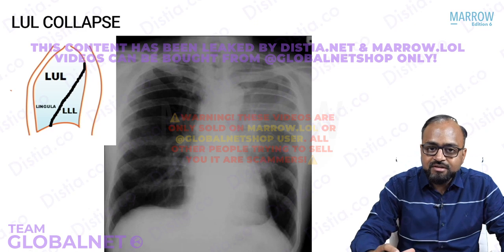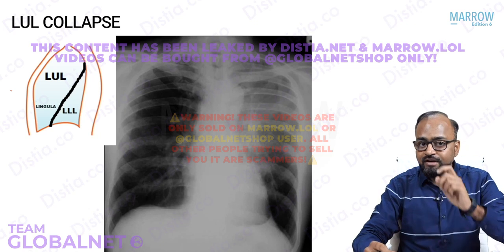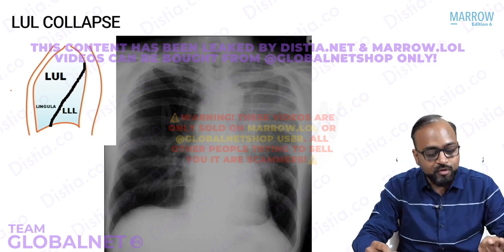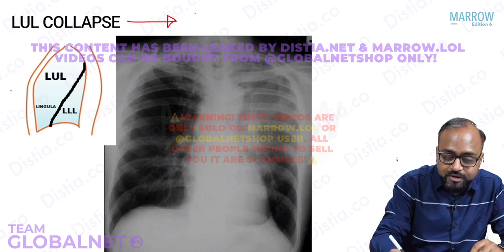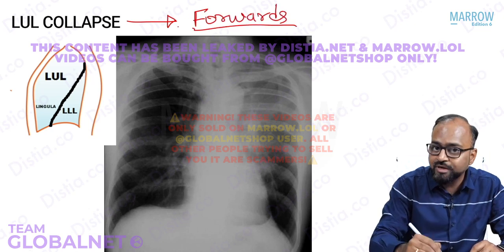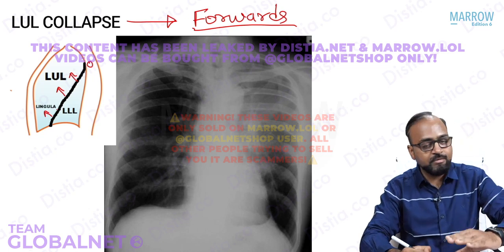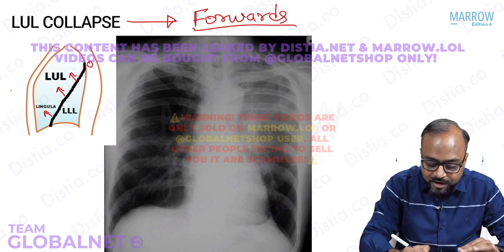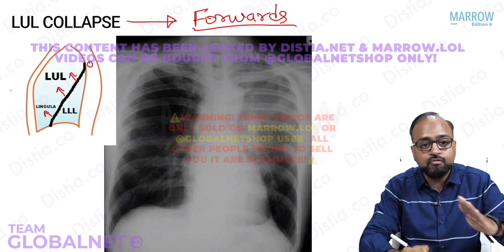See, now we have seen that the right upper lobe collapses upwards. But if I have to summarize in one word the collapse pattern of left upper lobe, I will say that left upper lobe does not collapse upwards, it collapses forwards. How is it so? Look at this schematic image. This is the oblique fissure. Everything anterior to, in front of the oblique fissure in the left lung is the left upper lobe, including the lingula. When it collapses forwards, it is going to pull the oblique fissure forwards.